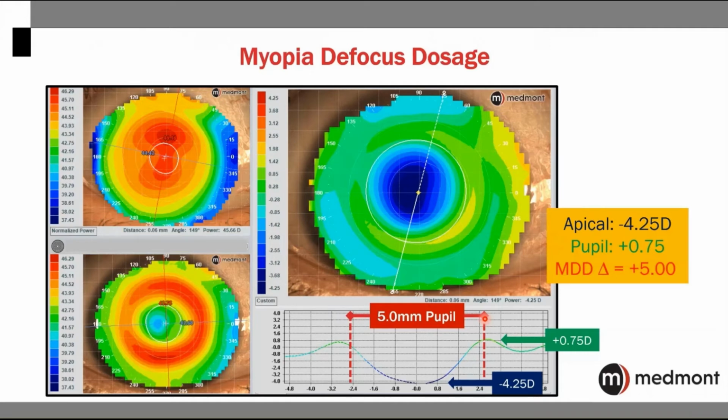or thought of another way, if this were myopia control with a soft lens, we'd want to use a high add product to try to slow down the eye growth. And for this ortho-K case, we're creating a 5 diopter add for this patient. What we would expect would be a very good myopia controlling outcome.